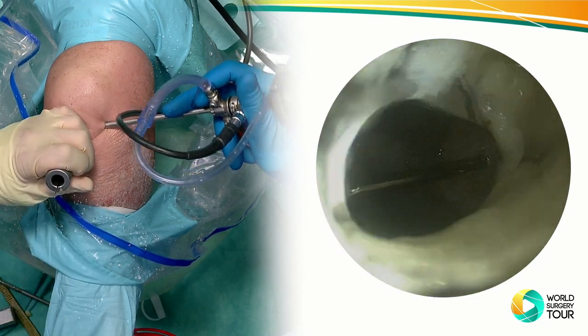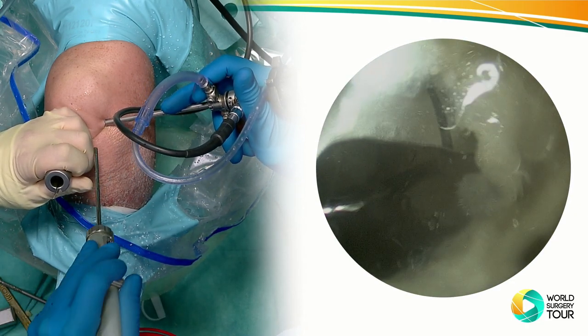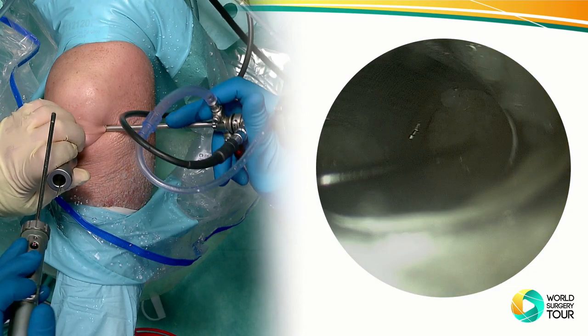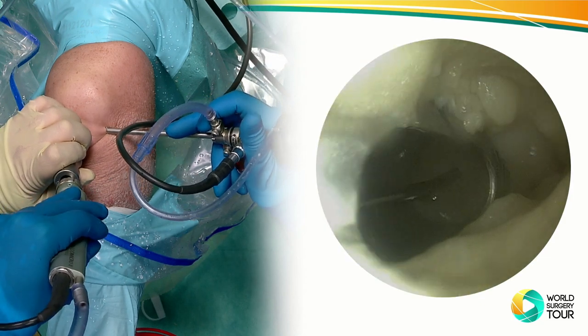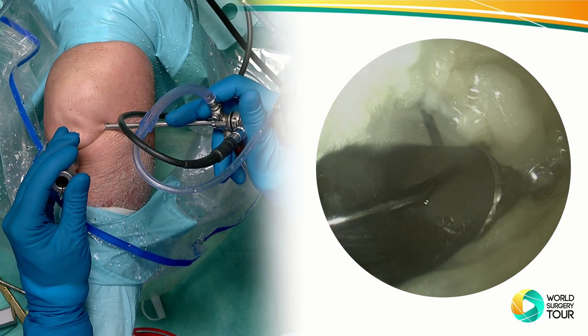Okay, now that looks pretty dry. So you like to do it in a dry way because of the glue? The glue and the cells, I don't want to have them move anywhere. Let's try that again. Yeah, okay, that looks good. As dry as we can get it. So now I keep the cannula.